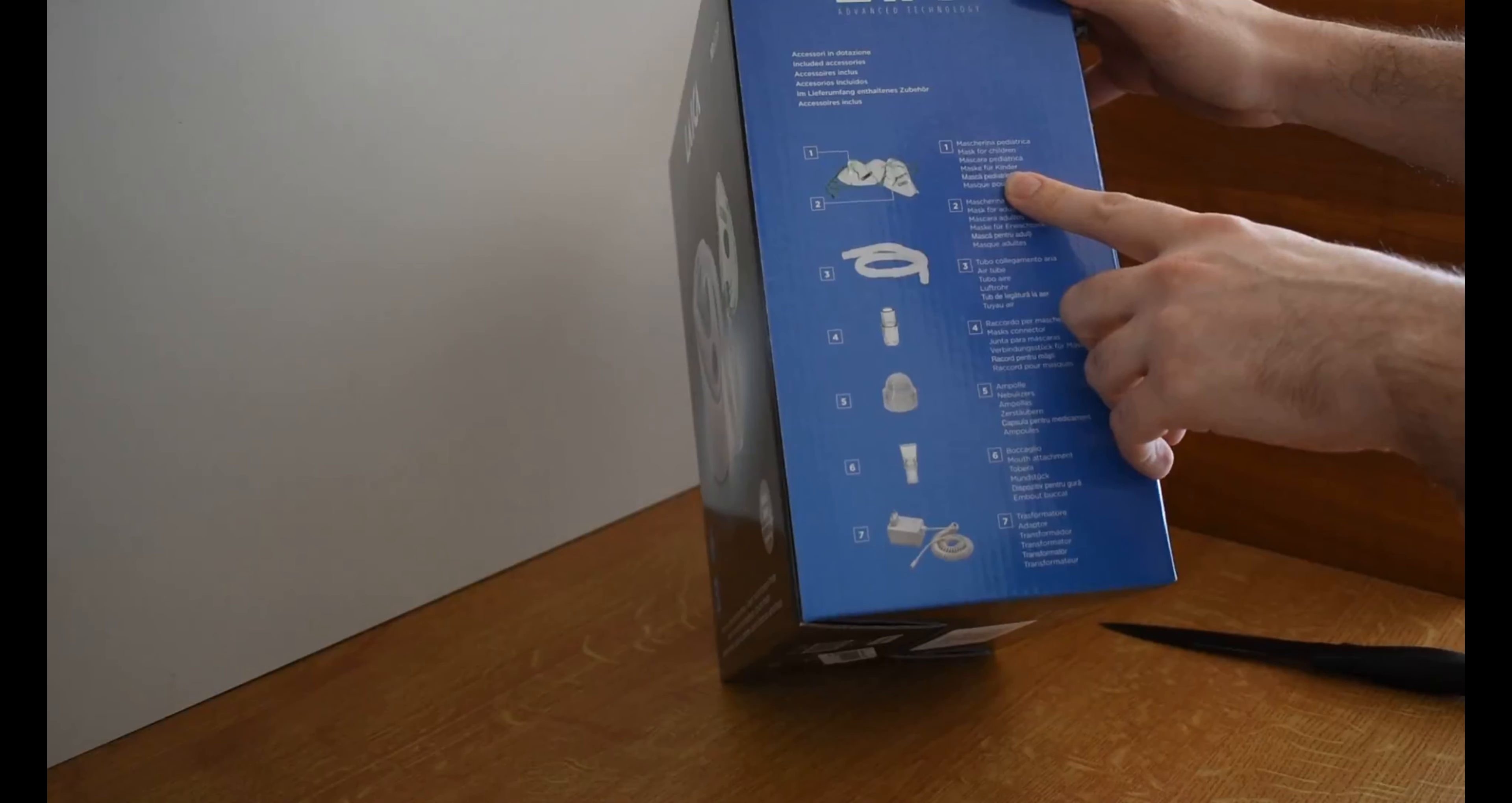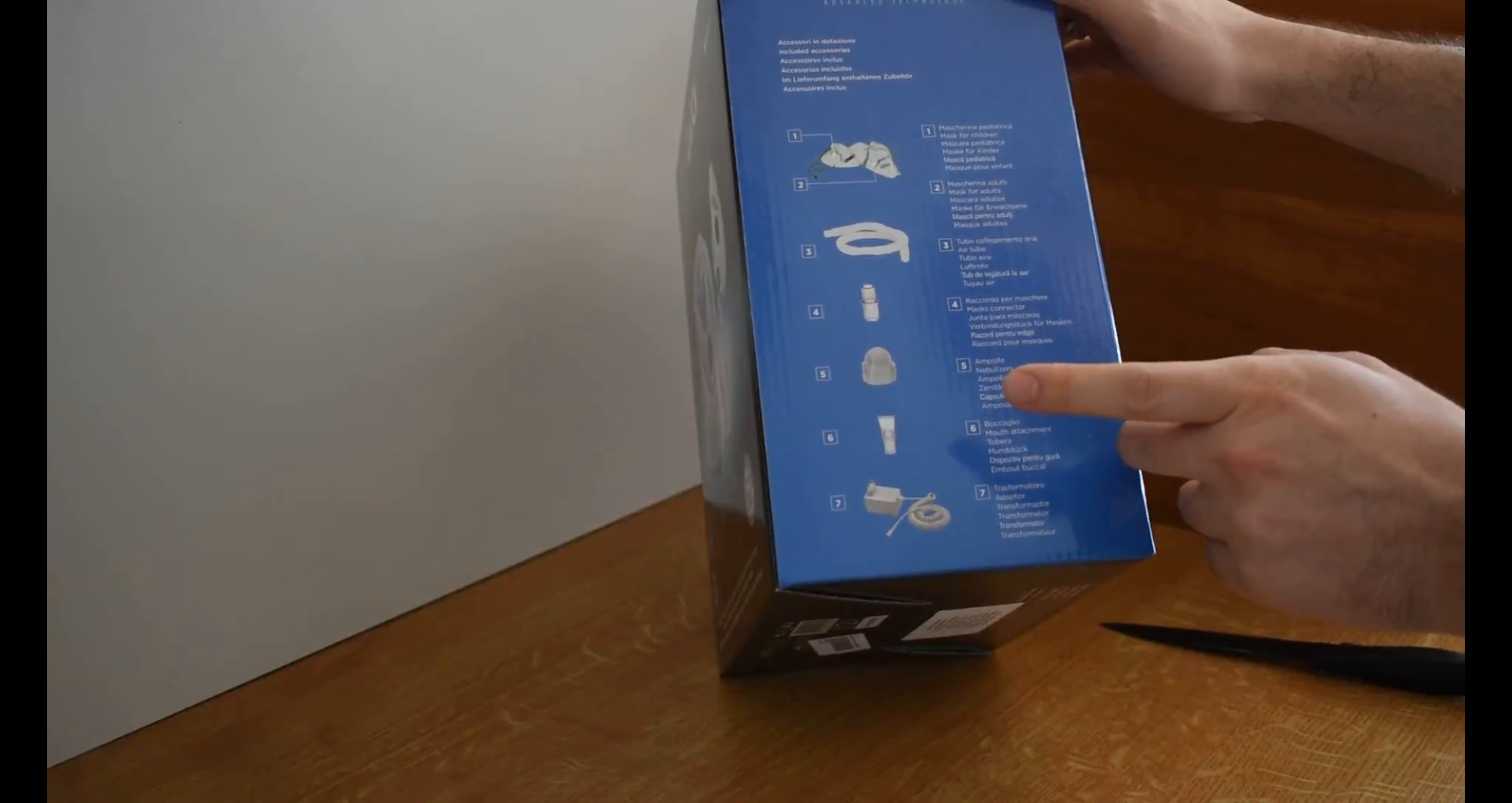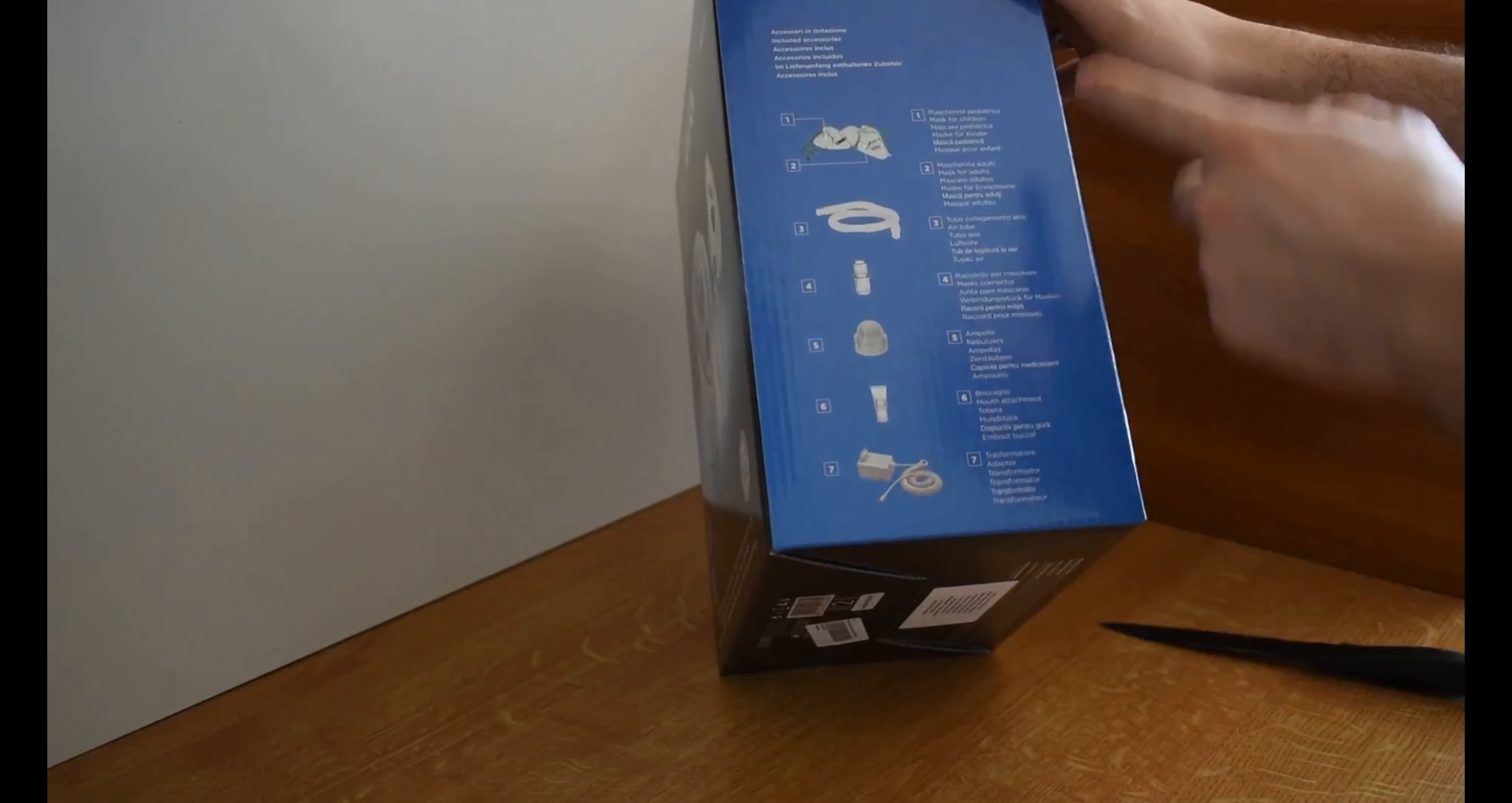The children mask and the adult mask are included in the box. The second item is the air tube. Then we have the mouth connector, then we have nebulizers inside of it, then we have the mouth attachment after the nebulizers, and this is the sixth item at the end. We have basically the connector of the machine.